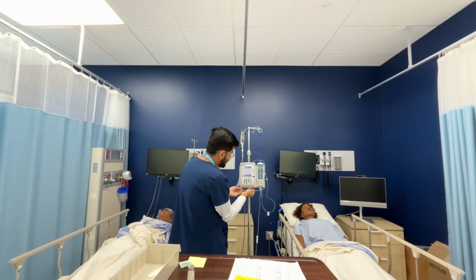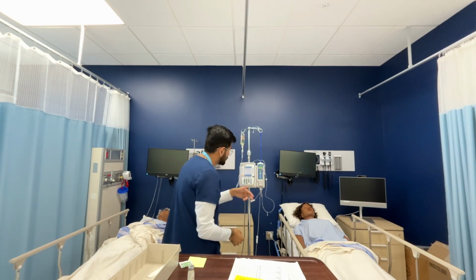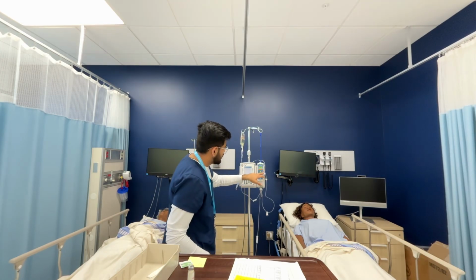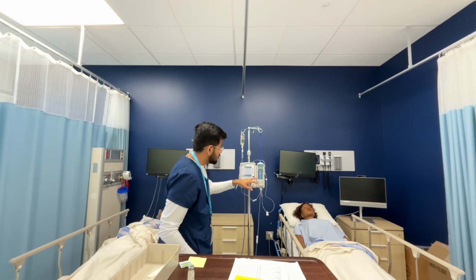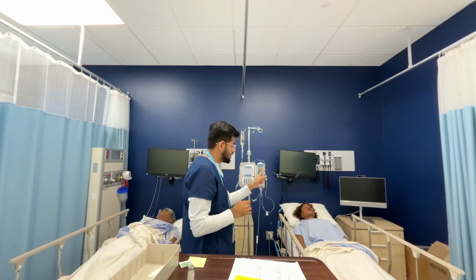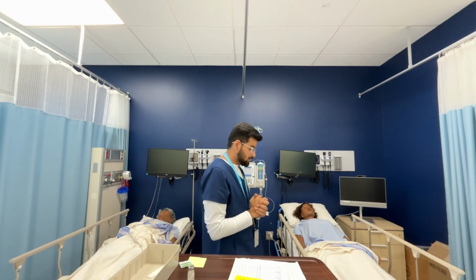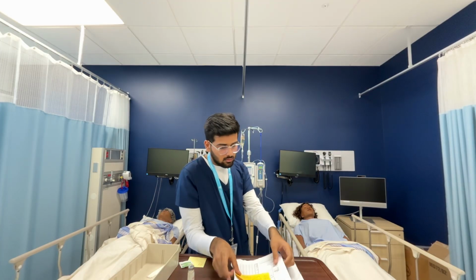I'll make sure that both the clamps are open so my medication can go through. Pantoprazole is running properly, 100 ml. So yep, I checked the secondary line, and the secondary line is running without any problem. Now I'm gonna go to Miss Fiona.